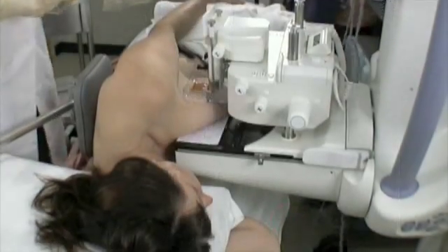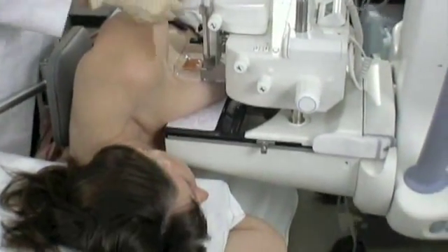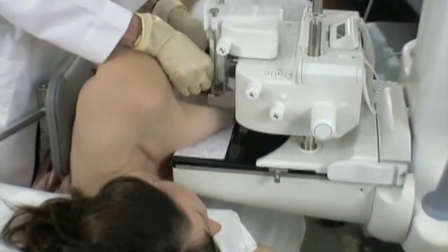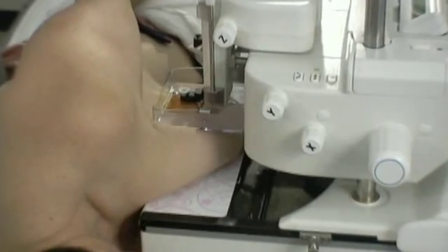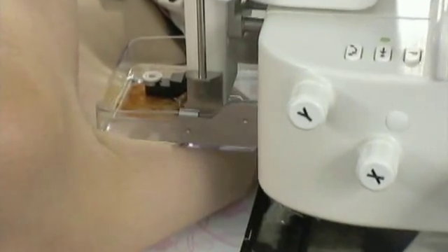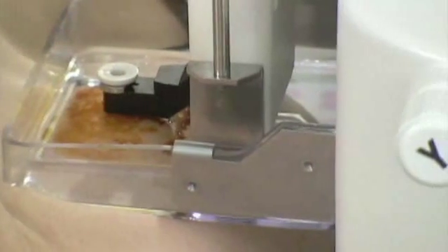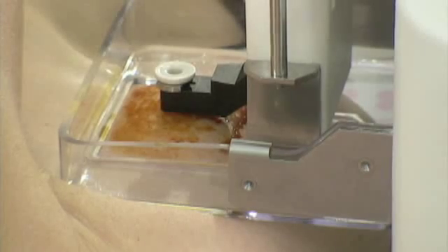We will fire outside of the breast on this case. Each needle manufacturer has a needle guide that comes with the kit. The needle guide is sterile and is placed on the machine at the time of the biopsy. We have zeroed our target so the calcifications are right below the needle guide. It's very important to confirm the position with the calcifications on the image, because occasionally in haste someone will forget to zero the target and remain on the last target.